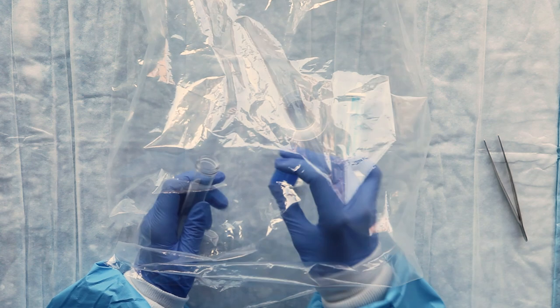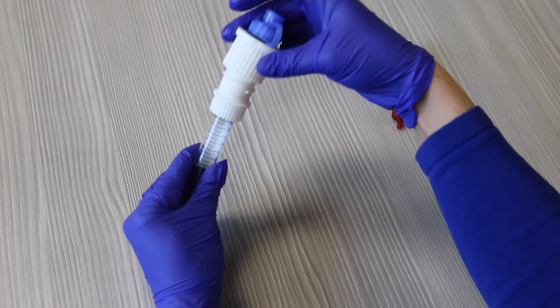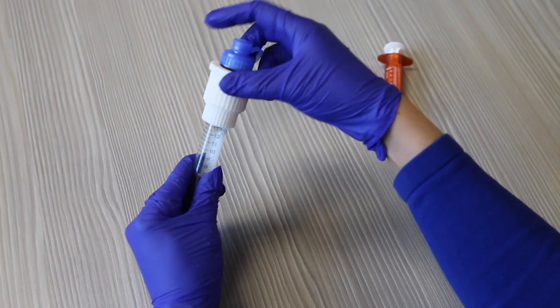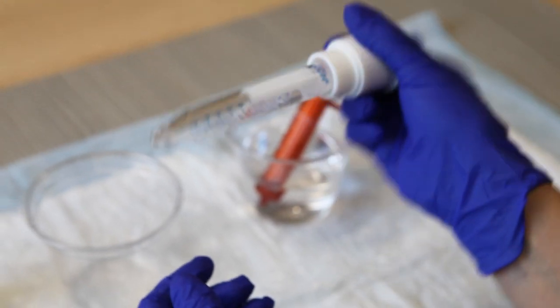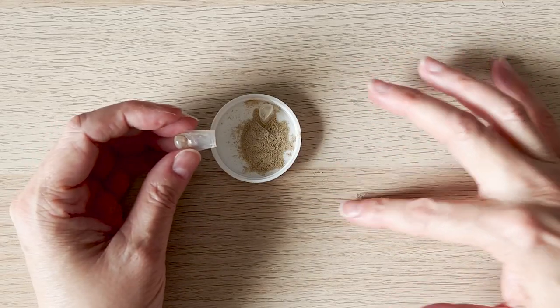But this can be a difficult and messy process. A capsule shredder is an adapter caregivers can add to a dissolve and dose device. It crushes medication capsules and mixes the contents within a closed system, reducing the risk of contamination or spillage of the medication.